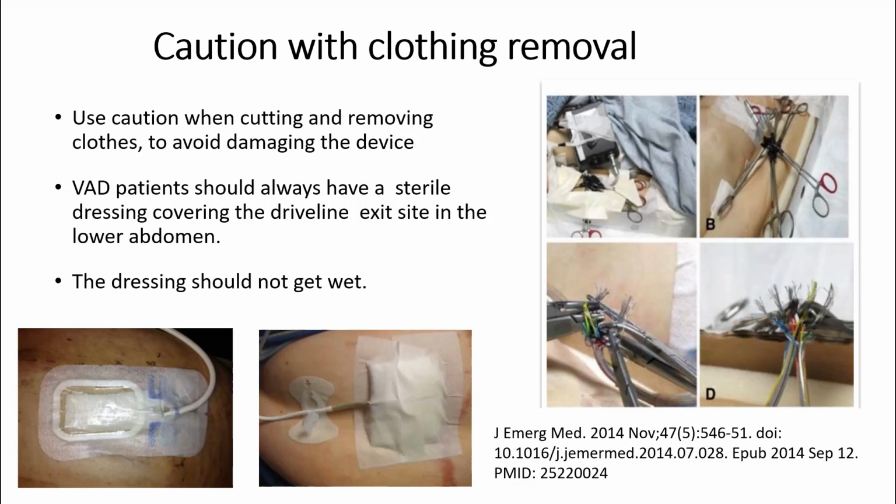The other thing is to not cut clothes off. Now, these images here are real images from a gentleman who was cutting his own diaper off so he could go to the bathroom. I would assume he was in a hurry. You know, he had that urge to go.